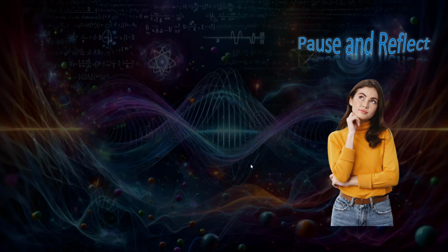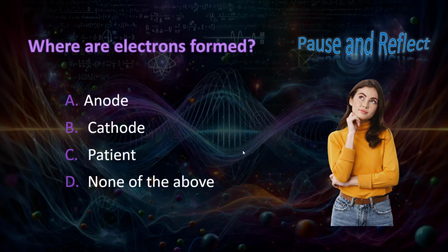So a little pause and reflect question for you. Where are the electrons formed in an X-ray tube? Is it anode, cathode, in the patient? Electrons come from the cathode. Remember, cat nap, cathode is negative. That's what has the filament, which emits electrons via thermionic emission.